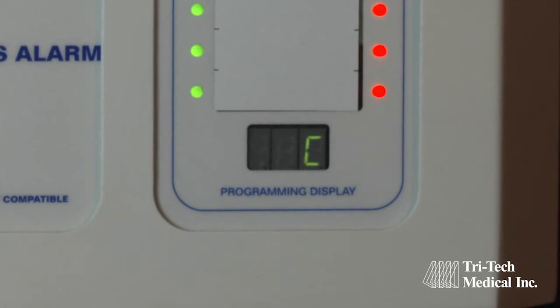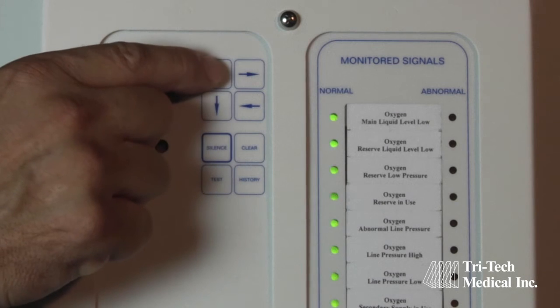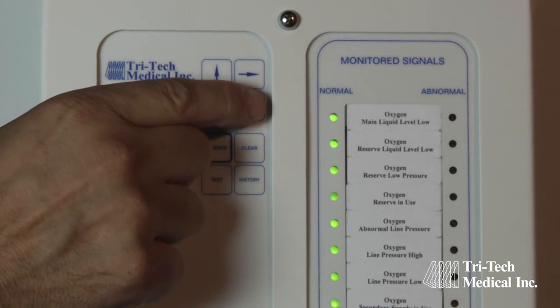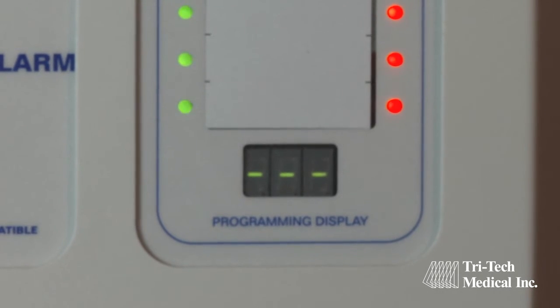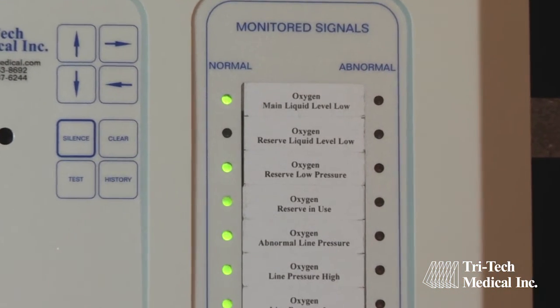In our example, the alarm panel is sensing a closed circuit for the first signal point. As source equipment is connected to this signal point and it is operating in a normal pressure range, we want to save this signal point with the green LED blinking on and off. Press either the up or down arrow button until only the green LED is blinking on and off. Next, press the left arrow button to save the programming of this alarm point. Horizontal dashes will appear on the LED display at the bottom of the board as confirmation of the saved program change. You have now completed the programming of this alarm point.